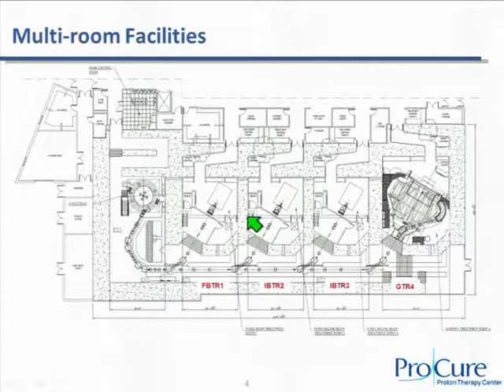Most of the desired energy that we get out of those accelerators is close to or above 200 MeV, between 230 and 250 MeV, that generates enough range in tissue, beyond or close to 32 cm, more than sufficient to treat most tumors.